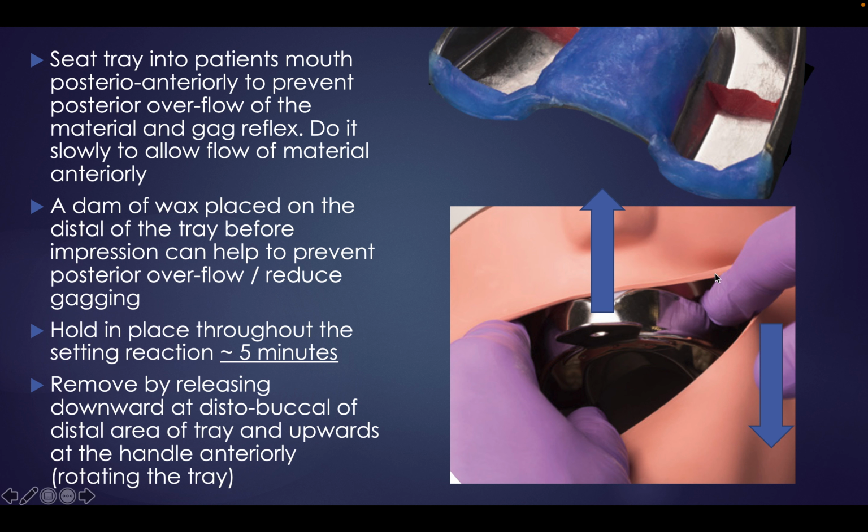So don't touch the material and say, oh, it's set. No, it didn't set fully. You have to wait the full 5 minutes. Do not remove it before the full 5 minutes. Wait for that. So once you seat it in, ask your partner to check the time, and you count.